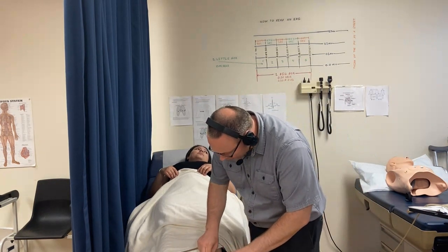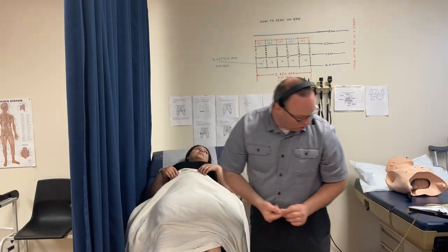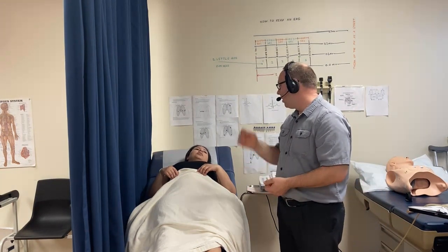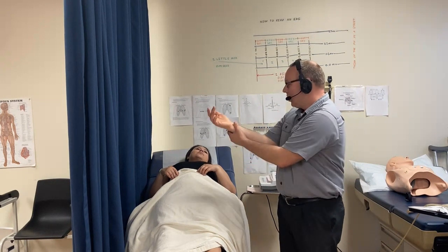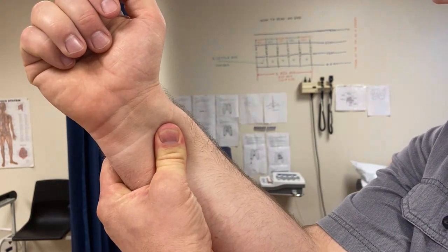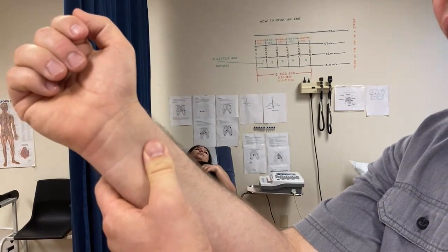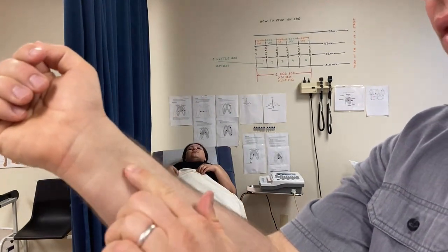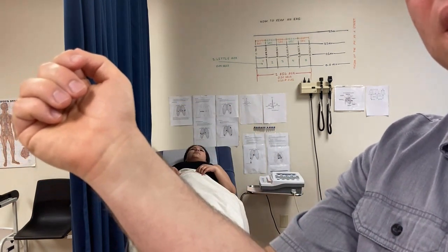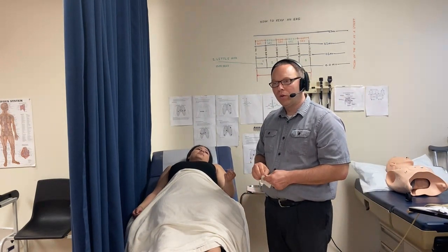Now do the same alcohol swabbing on the inside of her ankles. While you're down there, look for edema — swelling in the legs that can indicate heart failure. Squeeze the skin and hold for about ten seconds; if you see a big thumbprint dented in, that's pitting edema. Once the alcohol has dried, you're ready to place the electrodes.